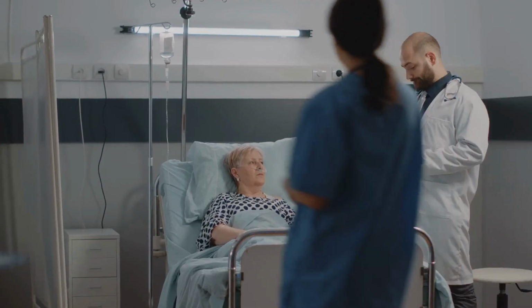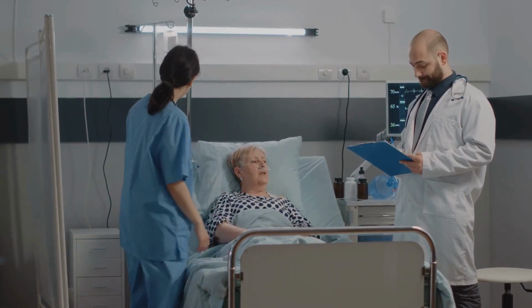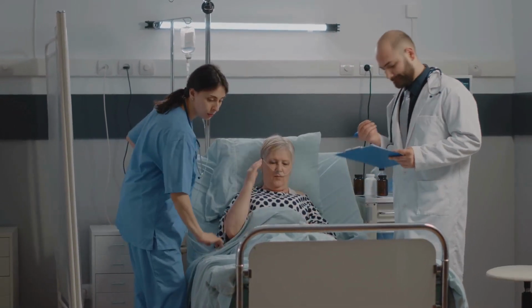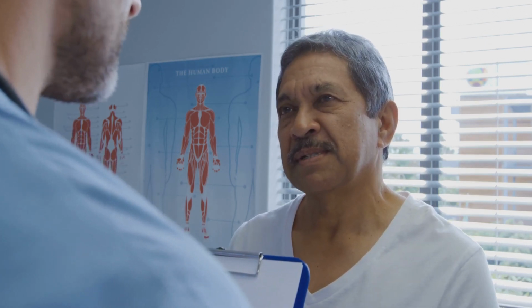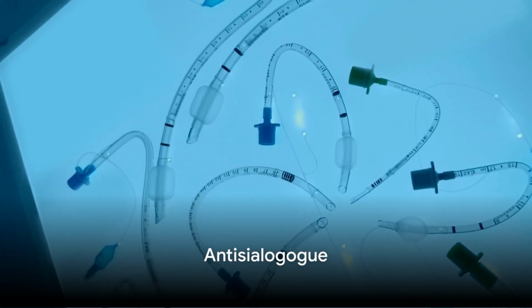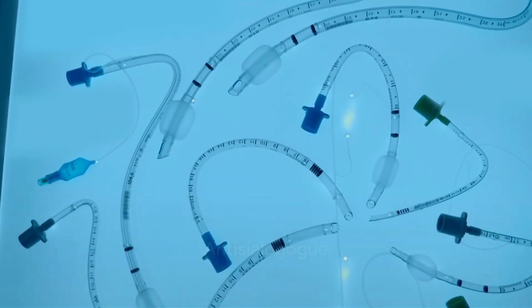Finally, involve them in the process. By giving the patient control over certain aspects, like holding the suction device, we can help them feel more engaged and less powerless. Remember, a cooperative patient is a cornerstone of successful awake intubation. Now, on to the technical aspects of awake intubation. The first step in the actual procedure is the administration of an antisialagogue.